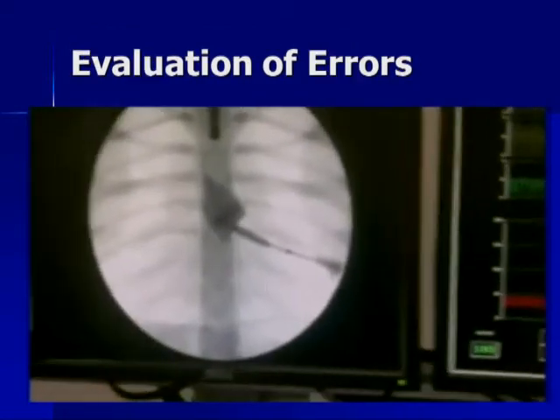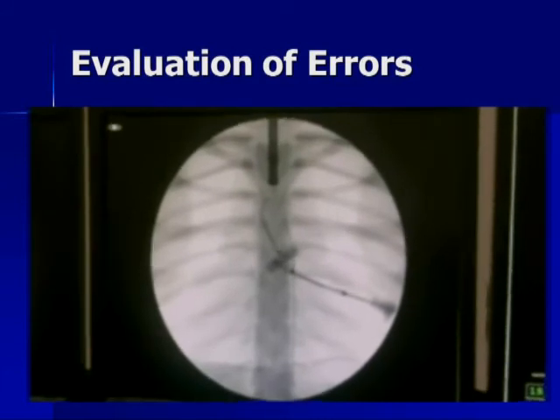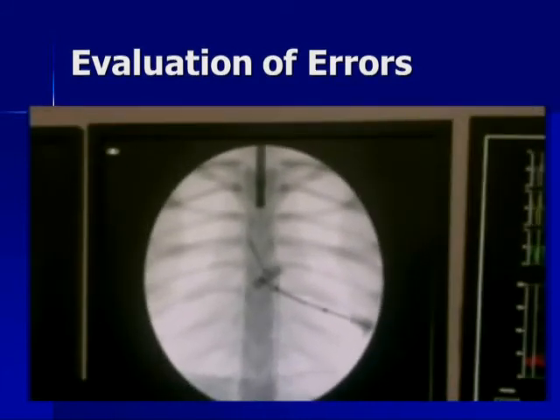Yep. This is an example of an error. We actually put this valve in. Okay, pacemaker off. The valve is covered up about 50% so that it doesn't embolize. And we inflated this valve without retracting, a critical step in the placement of this. But what it does is we're able to simulate an error in this situation, not following the steps for device deployment directly. And you can actually see the exact steps of this.